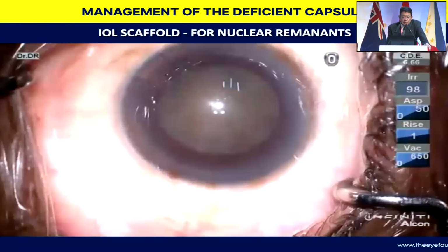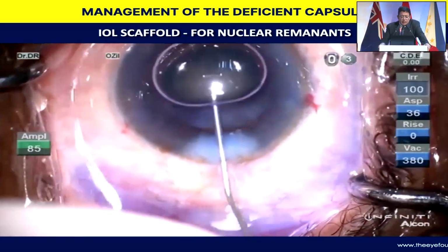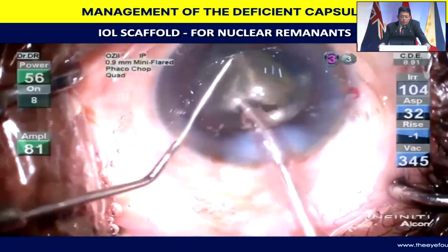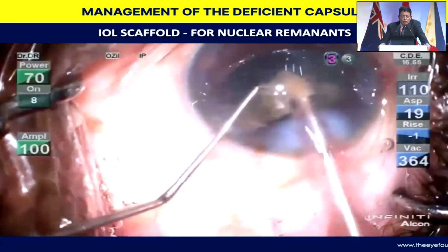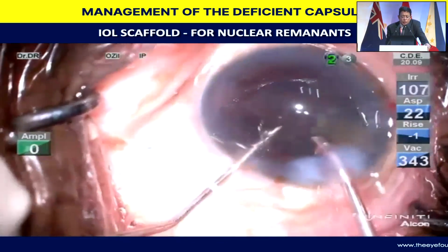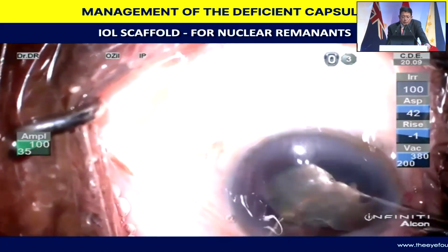And in case you have significant nuclear remnants still there and your anterior vitreous space is intact, I found this IOL scaffold technique, which was essentially brought up by Amar Agarwal, to be quite useful. You can see the one heminucleus is being removed quite completely. But before I reach out to my second bit of the heminucleus, I find that there is a fairly large rent over there. So essentially what I do is bring the second nucleus fragment into the anterior chamber. I'm maneuvering the nucleus fragment into the anterior chamber.